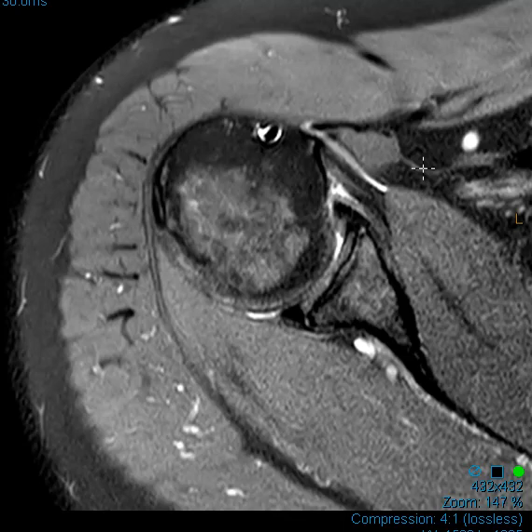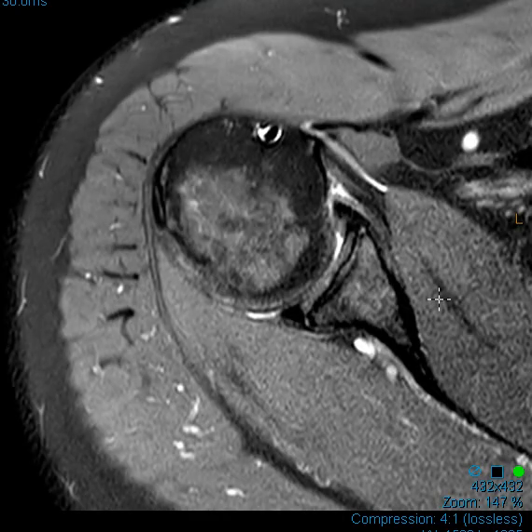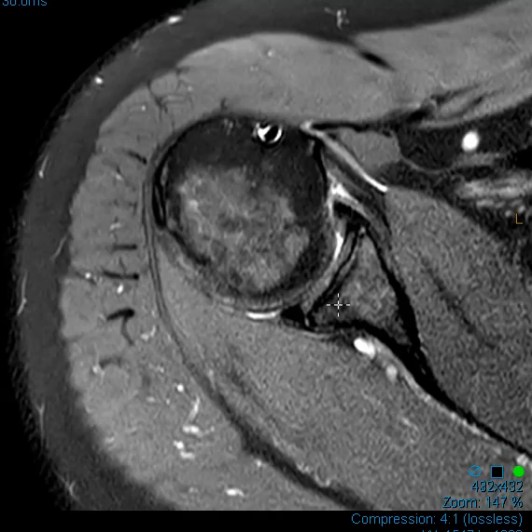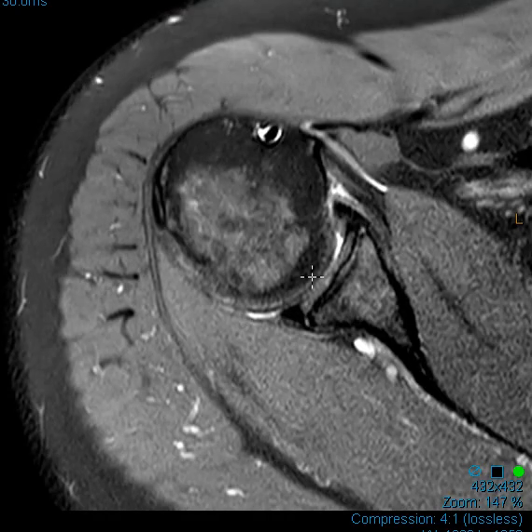This patient does have a labral tear, and I'll show you what this looks like along with the adhesive capsulitis. Here's his humeral head, here's the cup it rotates in — the glenoid. We see a little black wedge along the back, a triangle — that's the posterior labrum.